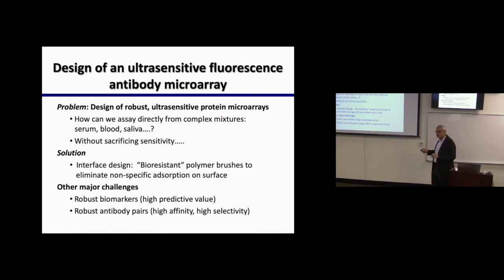We decided to go into diagnostics because we thought the fact that we can get rid of protein adsorption and cell adhesion meant that we would have a hope of working in blood because we have a very clean surface. Even if cells sort of settle on the surface, we should be able to gently displace them. And then, of course, if you want to build good biosensors, you need good markers and you need good detection reagents. We did not want to reinvent clinical diagnostics.